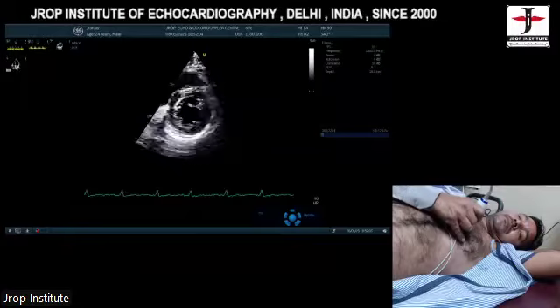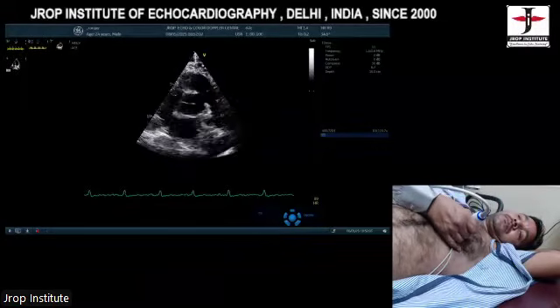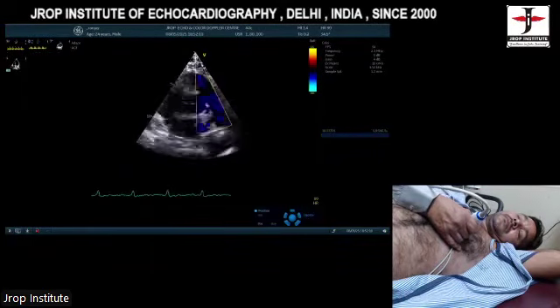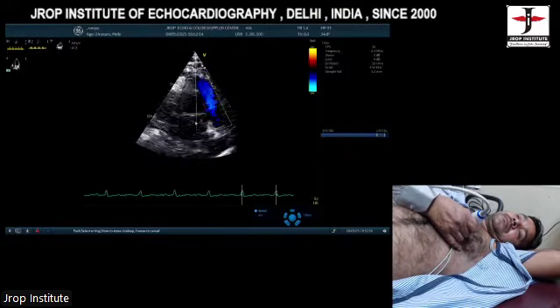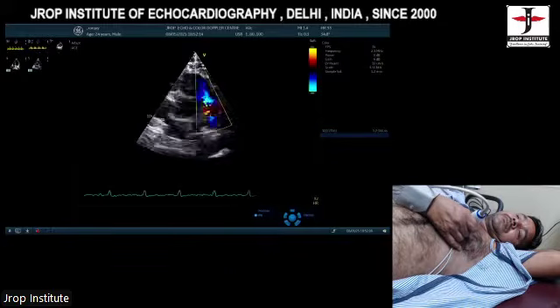This is mitral valve, 90 degree. There's slight footprints towards aorta. The aorta opens up and the pulmonic artery peeps out on the left hand side. Sir, on the left side, there is tricuspid valve, right? On this side? This side is tricuspid. Yeah. Okay, sir. Thank you, sir.